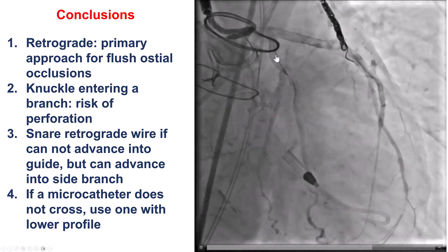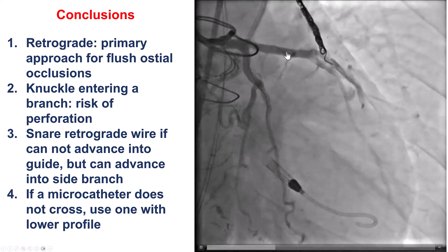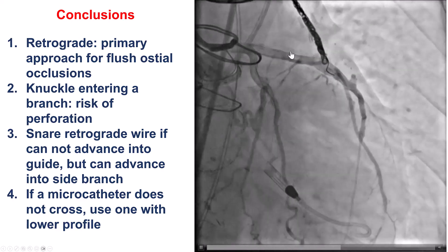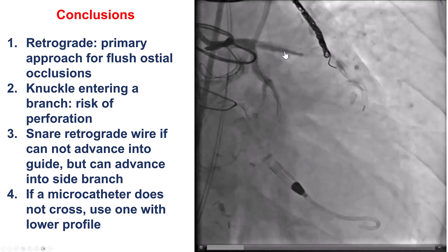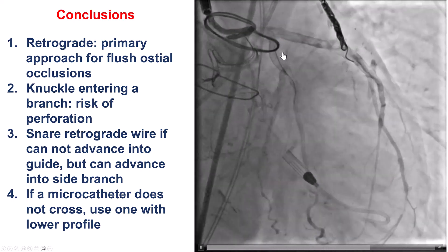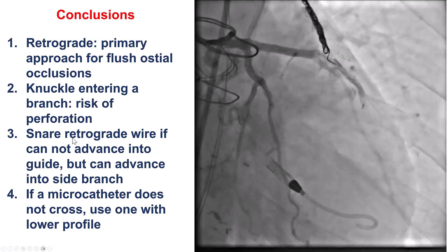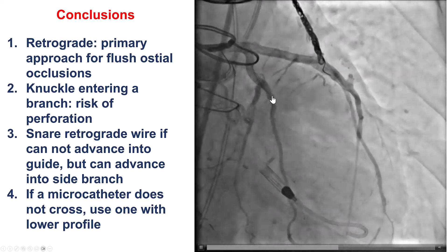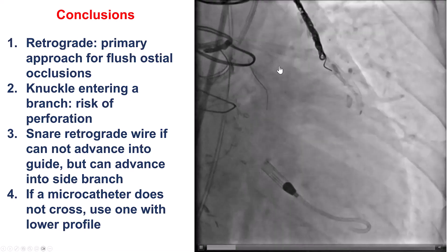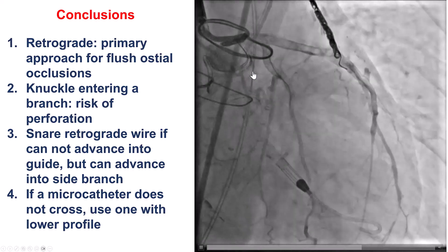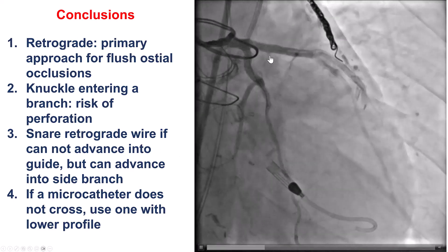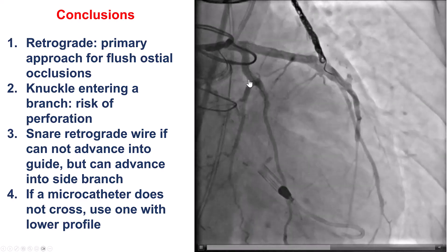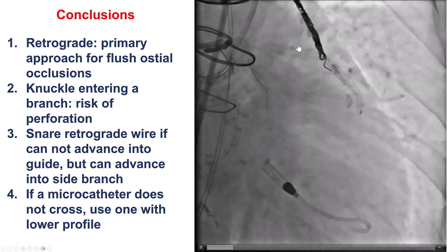In cases like this, the knuckle can actually perforate the vessel and cause pericardial bleeding. Here we placed a Papyrus stent and there was not a large amount of bleeding, but this is always important to keep in mind — knuckling is not 100% safe. One needs to verify that the course of the knuckle is as expected. Third, regarding snaring the retrograde guide wire: in this case the retrograde wire entered the circumflex and we had difficulty redirecting it into the left main. We placed a 2x4 mm snare into the circumflex and snared the retrograde wire. However, this came at a price — we dissected the proximal circumflex and had to use a two-stent bifurcation technique.